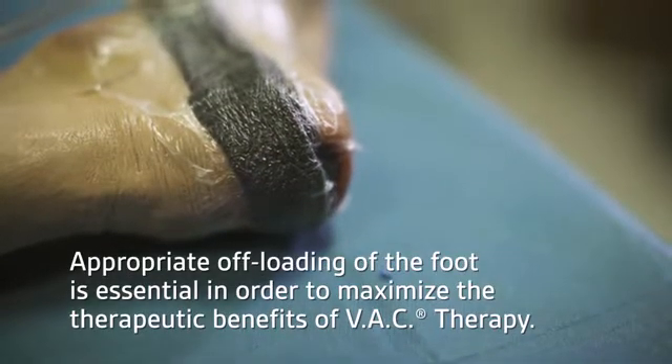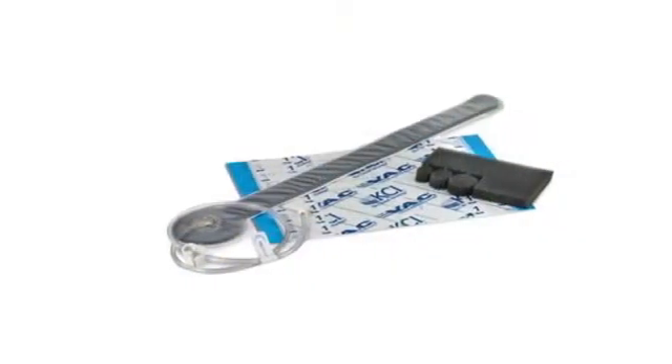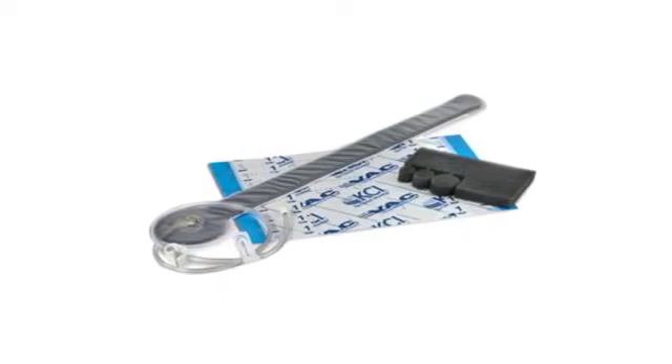As you can see, the VAC bridging technique is a good option for patients with wounds on the plantar surface or heel of the foot, or other weight-bearing areas where you're trying to minimize the chance of creating additional pressure points. Another option to make the dressing application easier is to order the VAC granule foam bridge dressing, which has an integrated bridge allowing the sensor track pad to be placed away from the wound site.